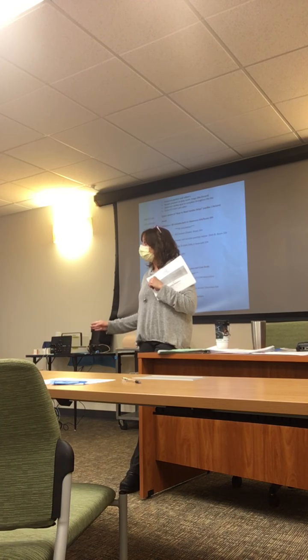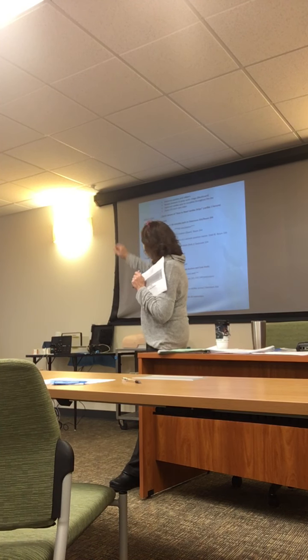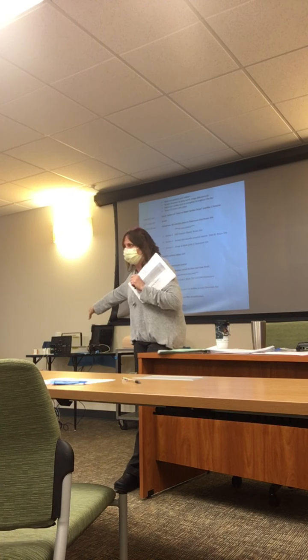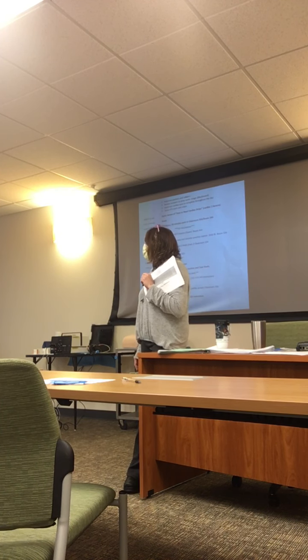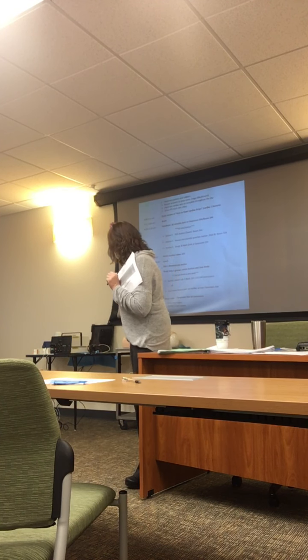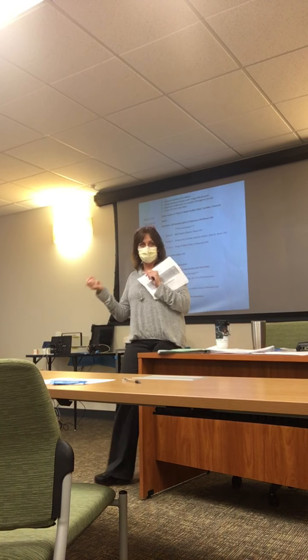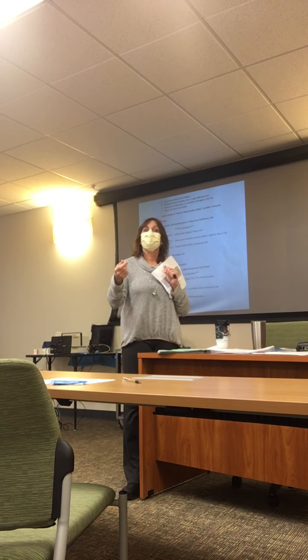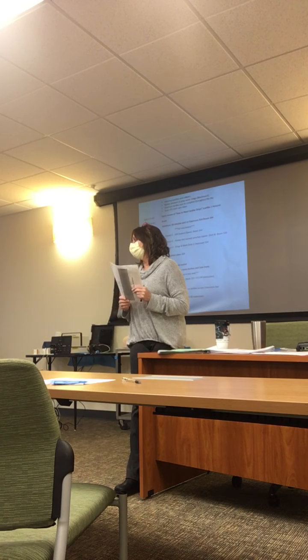And it's very scary for the patients and family because all of a sudden the alarm starts sounding in the room and they look up and pretty much everybody knows that that doesn't look like an awesome rhythm to be having. And the alarms are going off and the family comes running out, oh my gosh, somebody get in here, something's happening to my loved one. And you go in there and their leads came off or they got up and walked to the bathroom and didn't disconnect themselves. So always assess your patient with this rhythm.